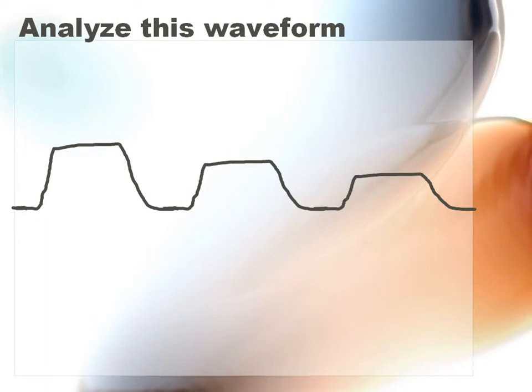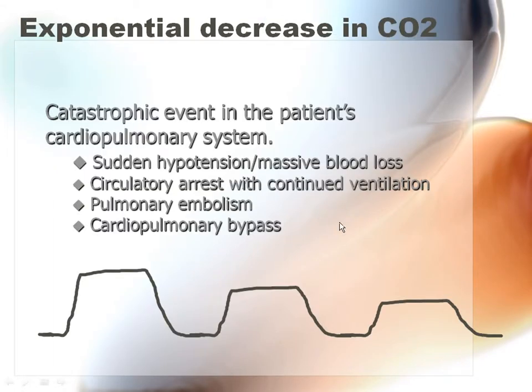What's up with this one? My thought was maybe less inhalation, less exhalation. Benzo overdose or some kind of respiratory depression. Yeah, whatever the case may be, they're breathing less. The breaths seem to be routine, but they're getting longer and less. Again, like I said, we're not offloading, because that's all we're measuring, just offloading. So, hypotension, massive blood loss. Basically, we're not offloading for whatever the case may be. That make sense?